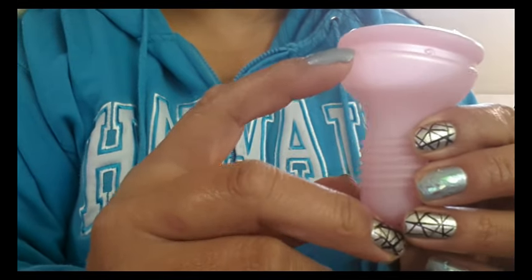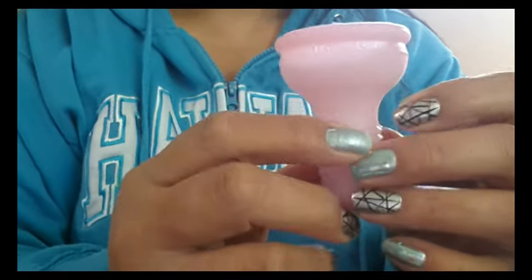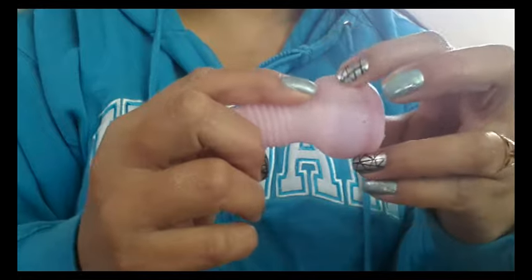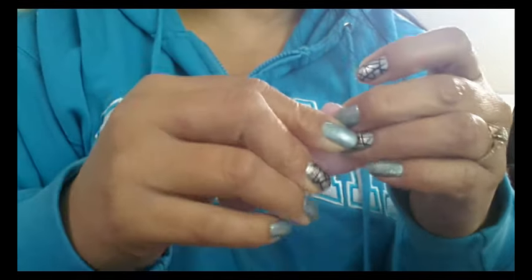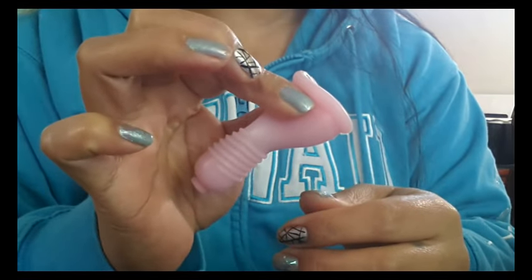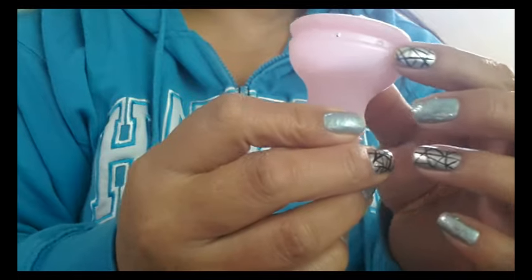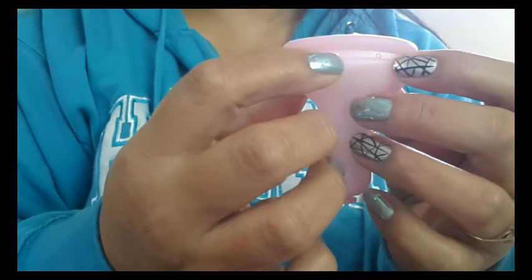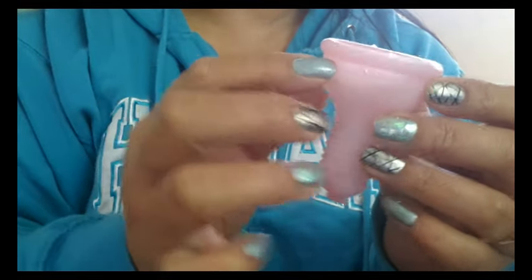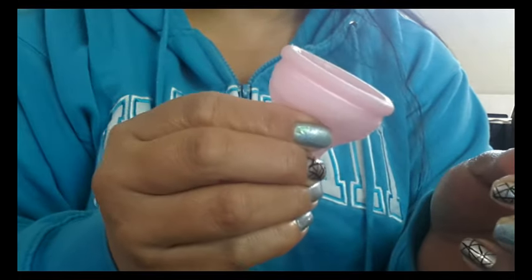There's a ring around the top right underneath the suction release holes, and it doesn't say anything about that in the instructions. But I'm thinking it's either a grip ring — so if you don't have the applicator you can hold onto your cup when inserting or removing it — or it could be like a secondary rim, because it is raised slightly off of the cup and a little thicker, which could help the cup pop open easier.